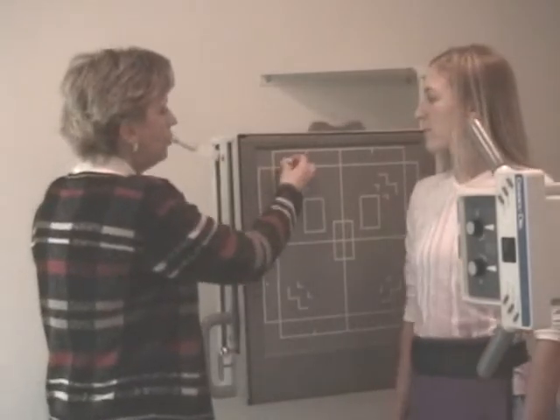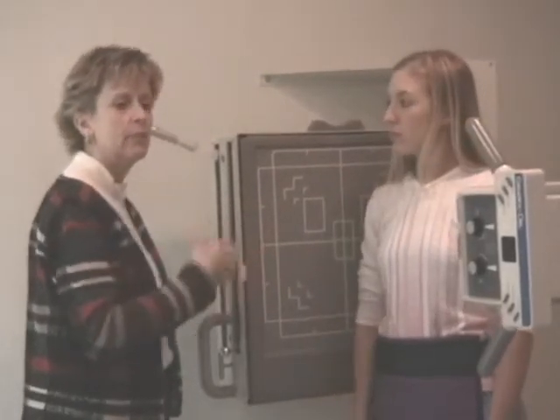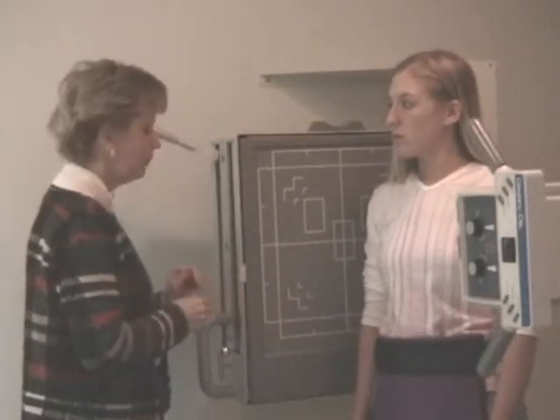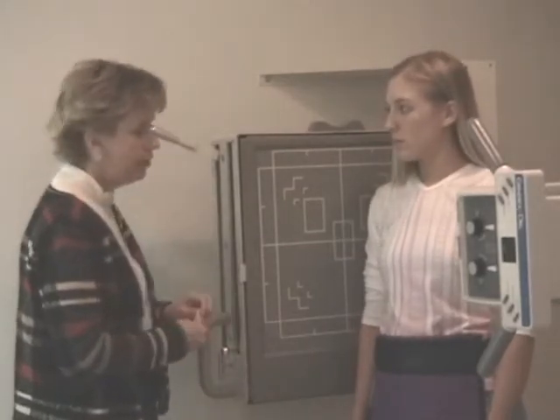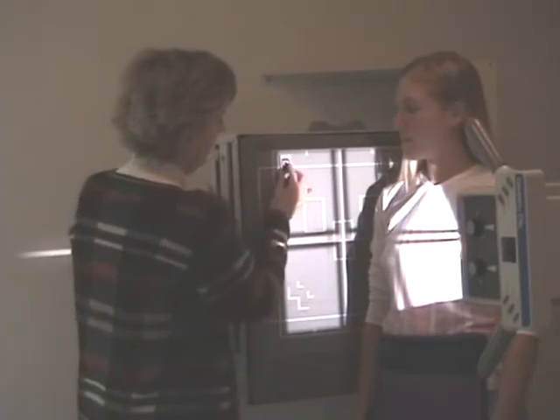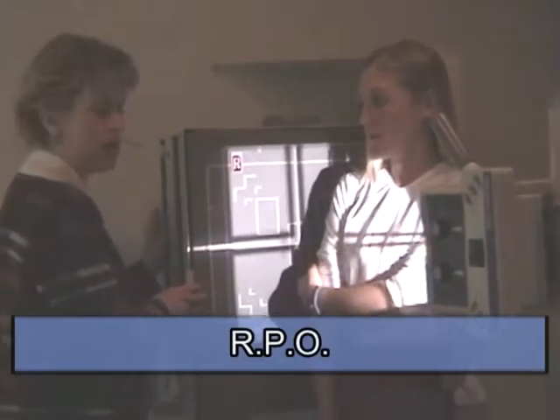And if I was doing this in a recumbent mode, I would do my AP small film next, so the patient doesn't have to move very much. But if they're walkie-talkie and they're already at the vertical board, it's not a big deal just to put them into an oblique position. So we would change films, ID blocker to the top again, 40 inches SID. And for a right posterior injury side, I'm actually going to do an RPO.